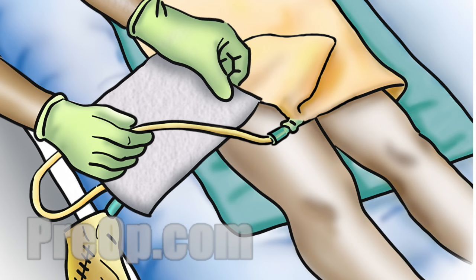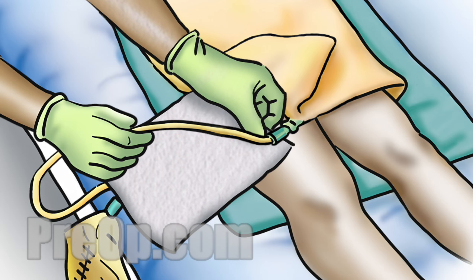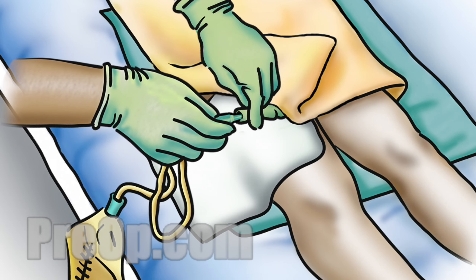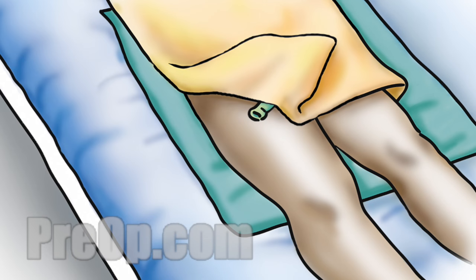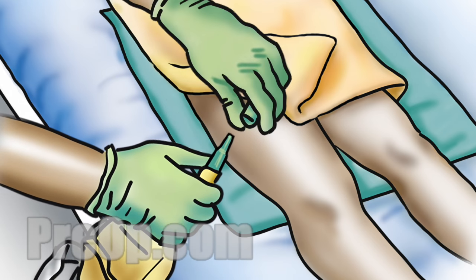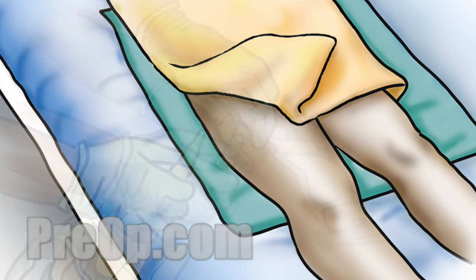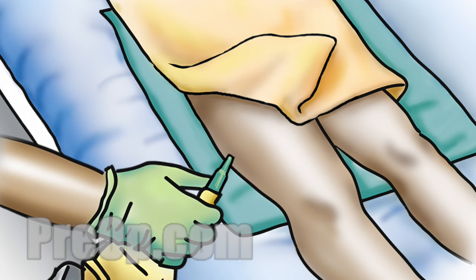Place a clean towel under the connection of the catheter to the drainage tube. Clamp the collection bag tubing so that it will not spill. Next, hold the catheter and the bag tubing where they meet and gently pull them apart. To connect a new leg bag, remove the cap from the top of the bag and gently push the tip into the catheter without touching the tip with your fingers. If you are reusing a bag, clean the tip with an alcohol wipe before connecting.